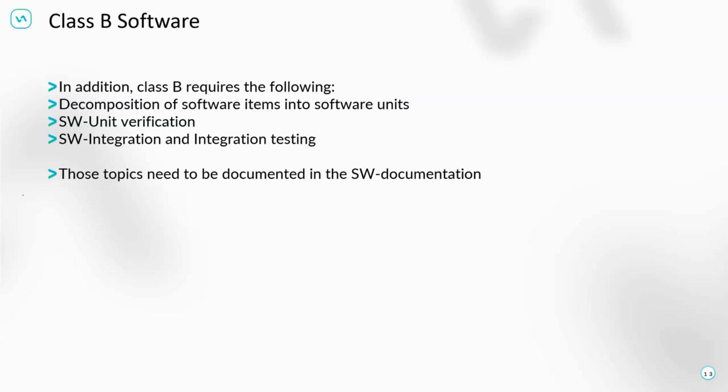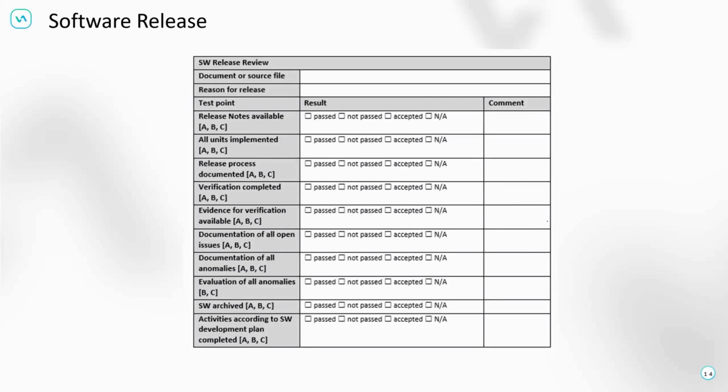If your software code is quite small and you do not want a big setup for that, then you could also use a code review and claim 100% code analysis and verification to ensure everything is done. But that is a discussion you need to have, how to do that best in your framework, because things like GitLab or GitHub already have very good automation frameworks, so you can have a very easy run through.